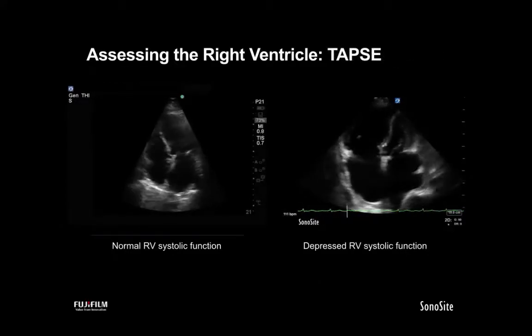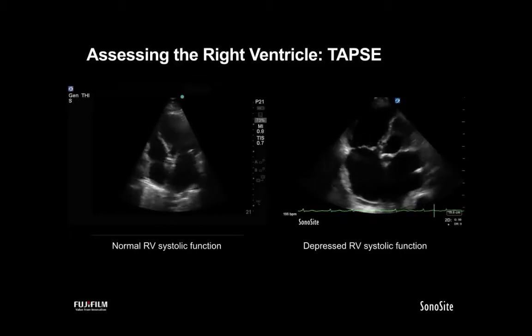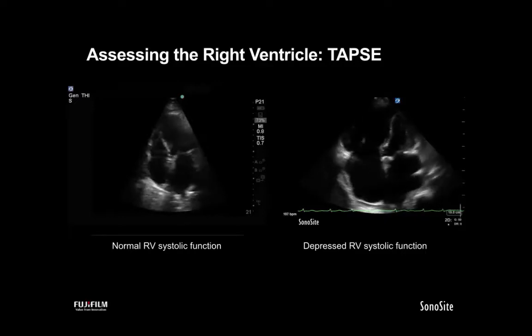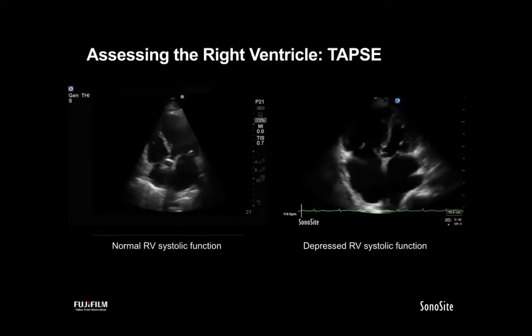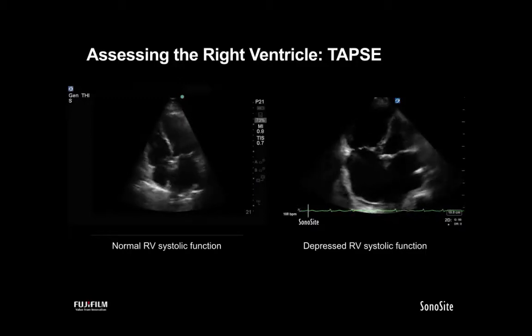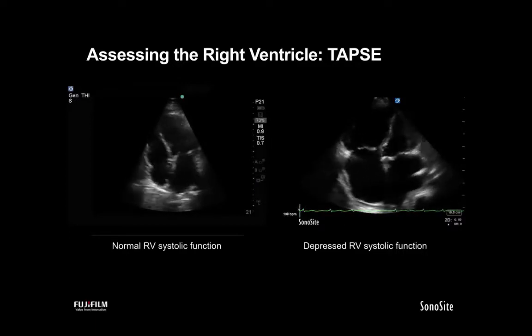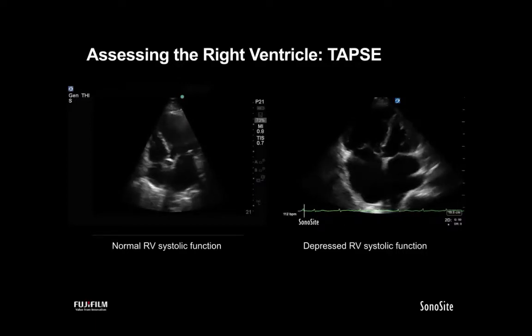Now, we're comfortable with the eyeball method for assessing the left ventricle, and we kind of stop there with the left ventricle. Though we notionally make mention of the Simpson's biplane method or fractional areas of shortening, many of us at the point of care don't find that additional detail and labor of that assessment of getting a number for an ejection fraction, for instance, adds anything beyond our clinical eyeball assessment. And part of that is because those techniques are very labor intensive.